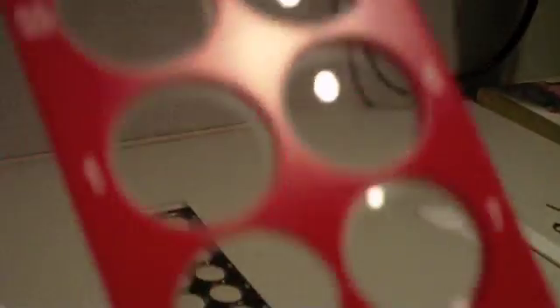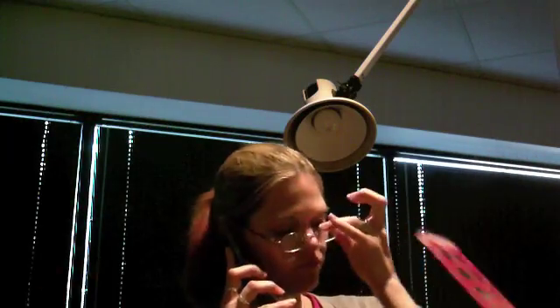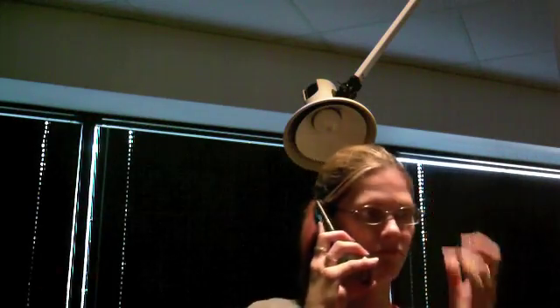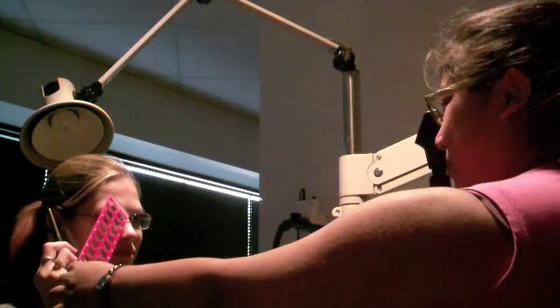If you don't have a phoropter, or if your patient is unable to sit behind a phoropter for very long, you can use what's called a lens rack, which has a bunch of different powered lenses in one rack. You have your patient put on working distance glasses, and then you do the same process — it's just not as precise this way.